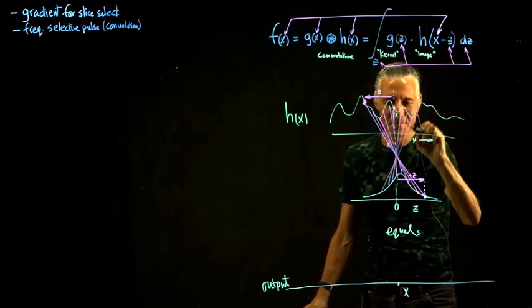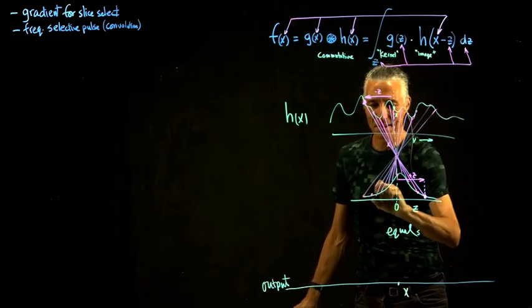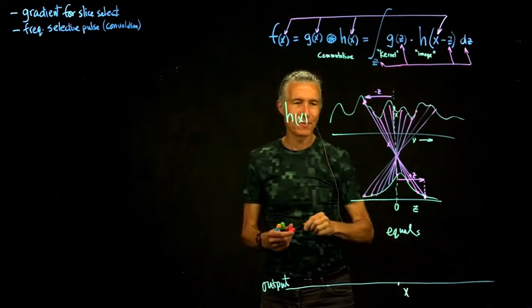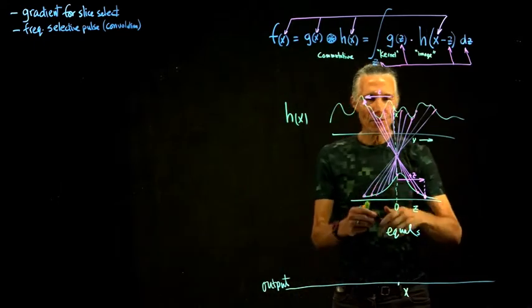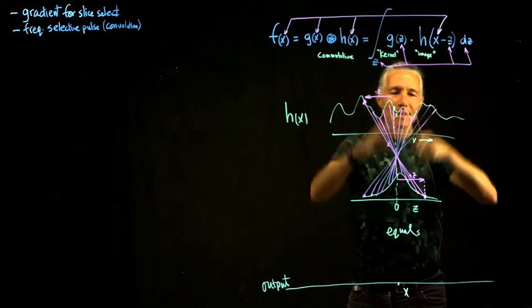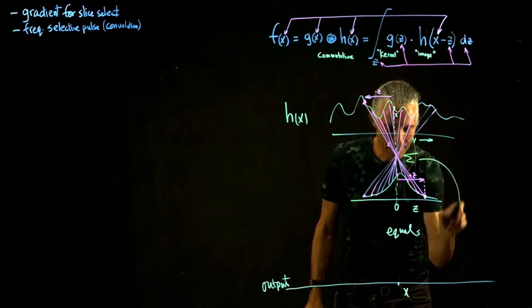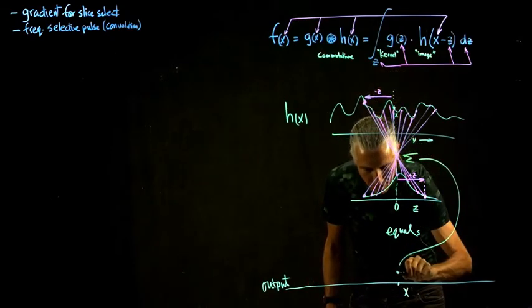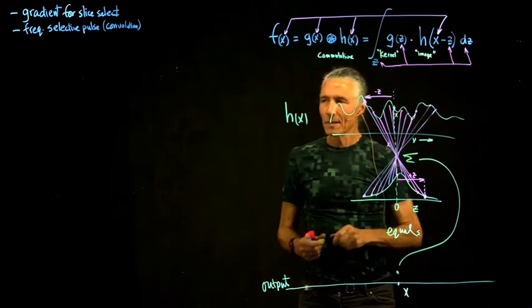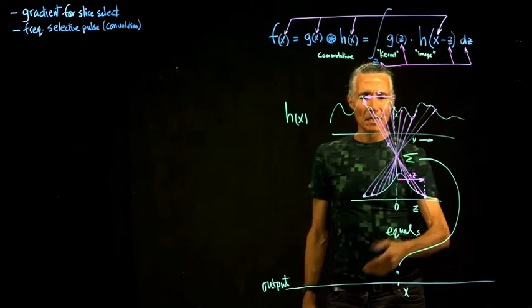It's flipping it back and forth. And we'll explain what the flip is for. But basically what you do is you do this whole sum, sum that whole thing up, and then stick that in for one number here. So that's what the convolution is.